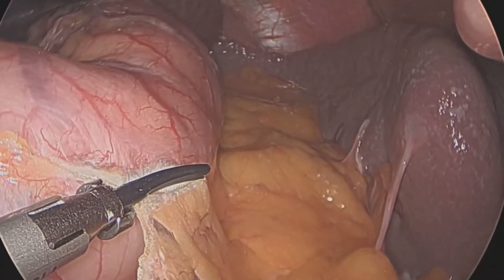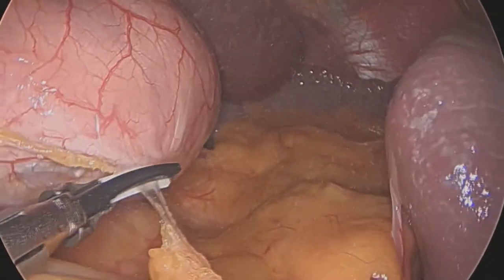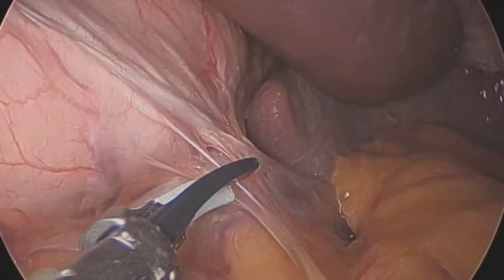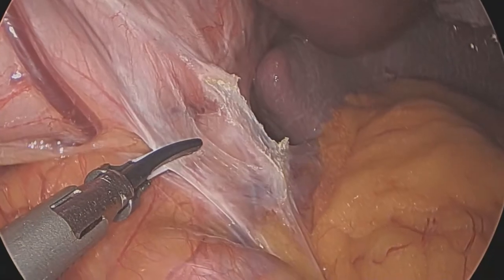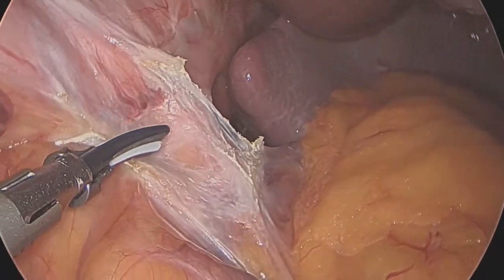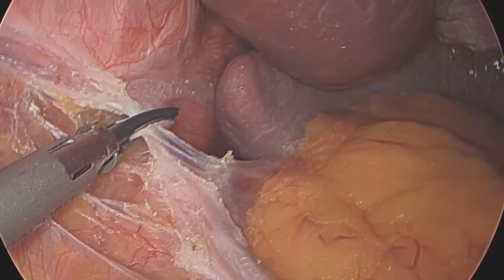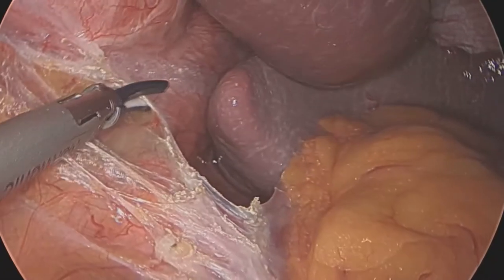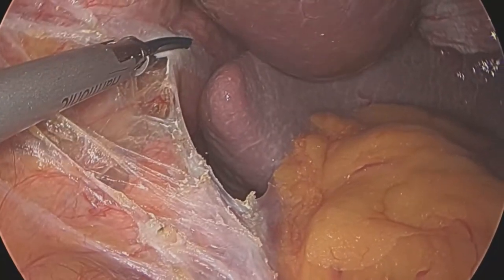If you have some experience with sleeve to bypass, it is like this: clearing the greater omentum, which is attached to the previous staple line. The surgical principle is the same. You have to mobilize the fundus and clean up to the left crus like this. Exposing the crus muscle is also a critical step for any revision surgery, band to sleeve or sleeve to bypass. Exposing the left crus is a critical step for a successful revisional surgery.